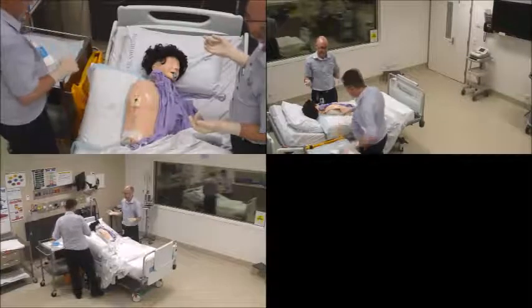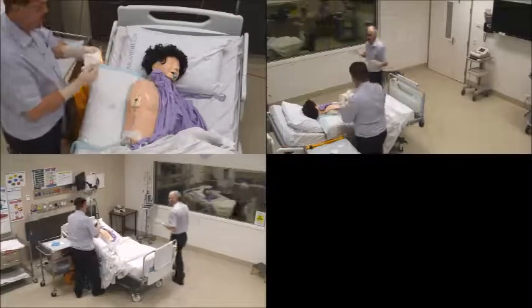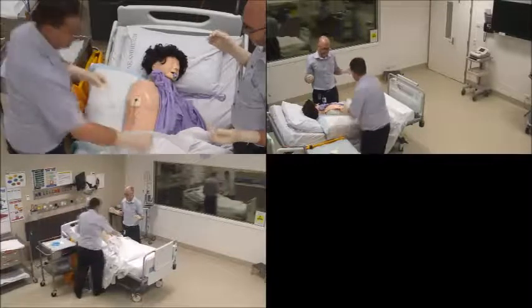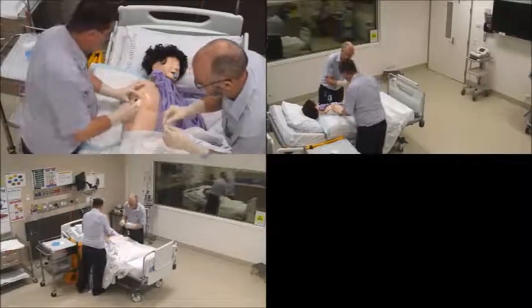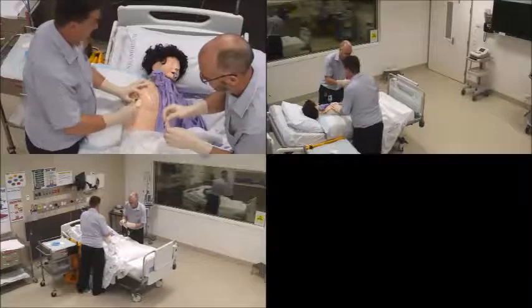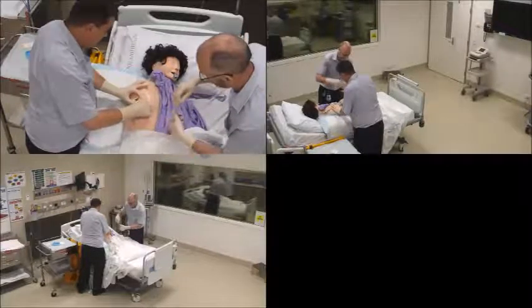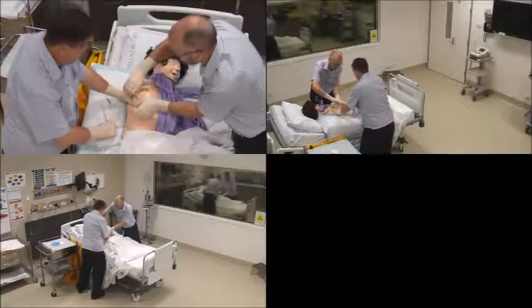Okay, you ready? Alright. Kim, I'm going to pass over to you the dressing with Steri-Strips. I'll just pop them on our little sheet there. Put a Steri-Strip and your dressing. Okay, you ready? Okay. So, Scott, breathe in for me and breathe out. Breathe in, breathe out. Take a deep breath in and hold it. Okay, just cutting the suture now. Removing the chest drain and pinching.